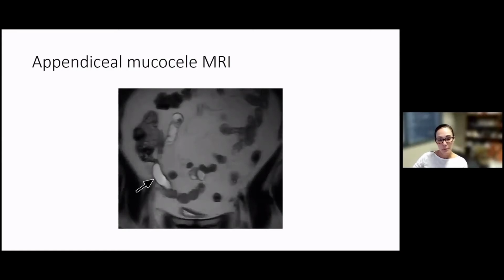Now, this other image that I'm showing is what we call a T2 image, and that is sensitive to fluid or fluid-like structures. So this is showing here an appendix that is abnormal with fluid, but also shows a little bit of the bladder with fluid and some small bowel loops with fluid. So with MR, we need these different sequences to show and characterize a lesion, whereas with CT, it's mostly contrast or non-contrast. There are not that many different sequences or phases.